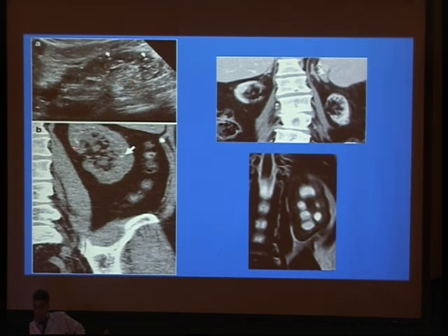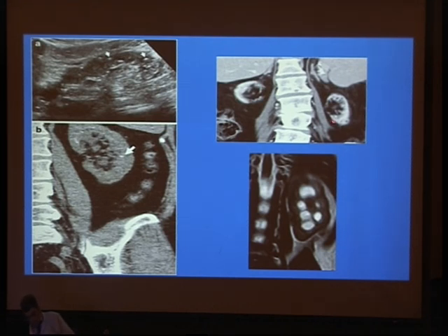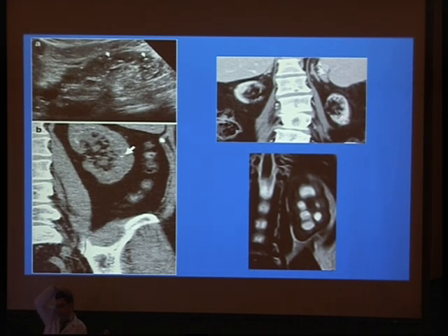At CT, you can get the same findings, but you have to account for the risk of radiation and the higher cost compared to ultrasound. On CT you can find a small-sized kidney with multiple papillary calcifications and irregular renal contour. At contrast-enhanced CT, you can see bilateral small kidneys with irregular contour and reduction of parenchymal enhancement in the case of renal impairment.